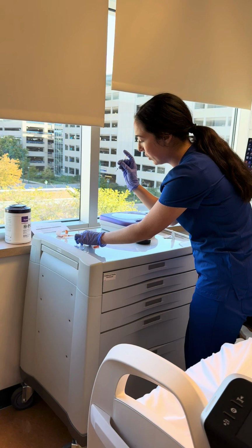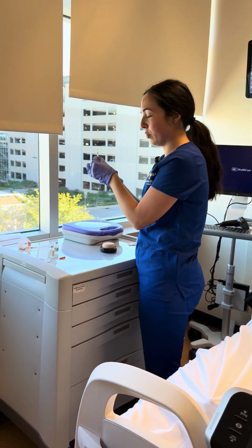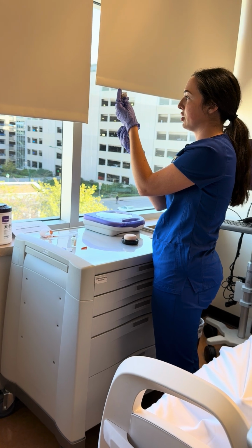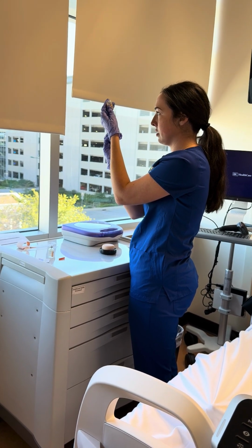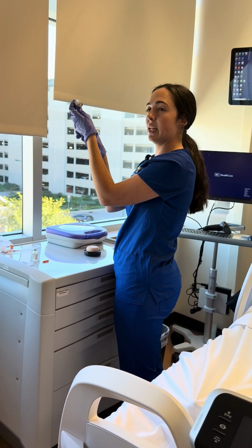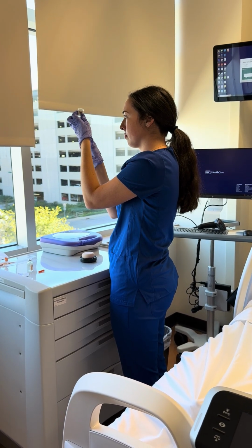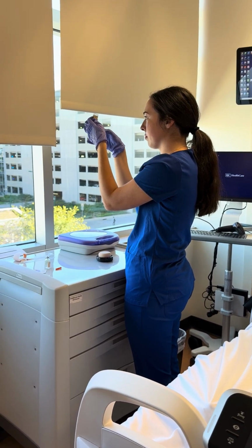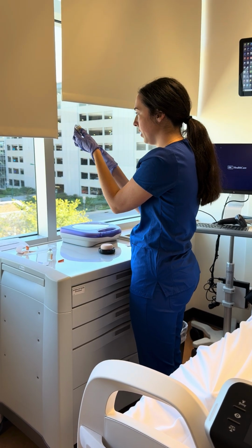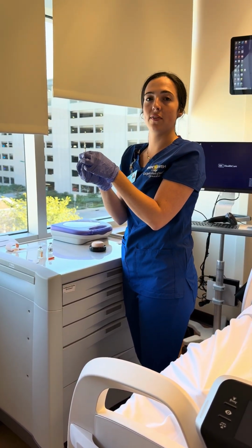All right. So I'm going to remove that and I'm now going to draw up 7 units of air. 6, 7, and I'm going to inject that into my regular insulin. 7, and now I'm going to draw up my medication. So I'm making sure it's in the liquid, and I'm drawing up 7 units. I'm flicking out any air bubbles. All right, drop this down. Perfect, I've got 7 units, so now I'm going to add 17, so we'll have a total of 24 units.